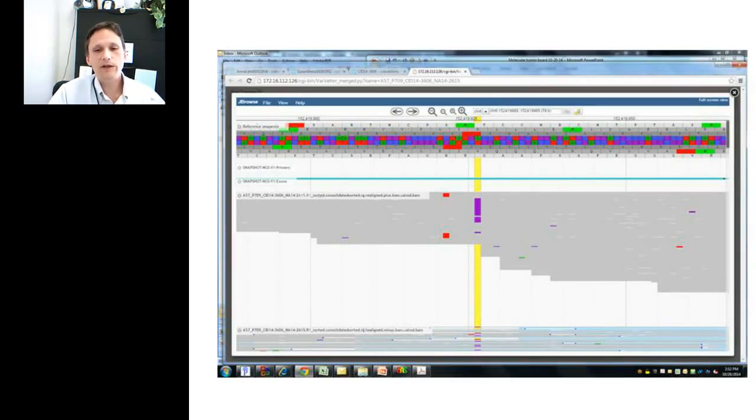You don't really need to see the detail of this. This is a slide pileup using our custom viewer that Long has developed. It's a pileup around one gene. I'm showing you just the plus reads up here, the minus reads down here. Let's ignore those. You can see this pileup over this particular gene. I don't remember which gene it is. It's very blocky. So you have many nucleotides here. You probably have 20 nucleotides between here and here, but you have no reads that start or stop there. And so this is a very low complexity sample.